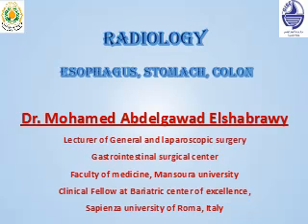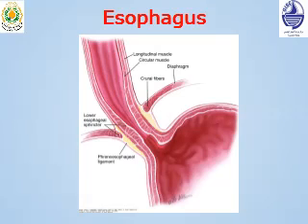Today we are going to speak about radiology in general surgery. We will discuss radiological findings in the esophagus, stomach, and colon with different diseases. First of all, I want to greet you and invite you to start to take up some hints about the different diseases that we will discuss today. Let's start with the esophagus.